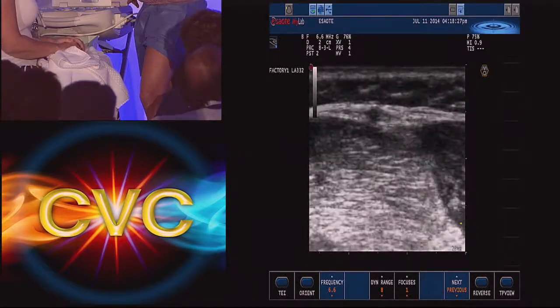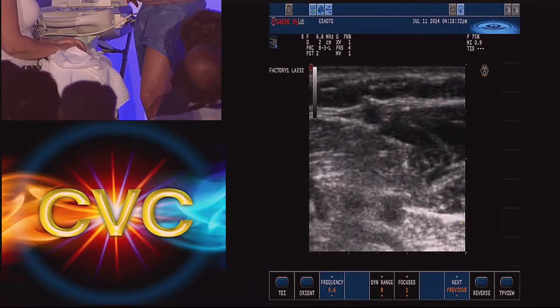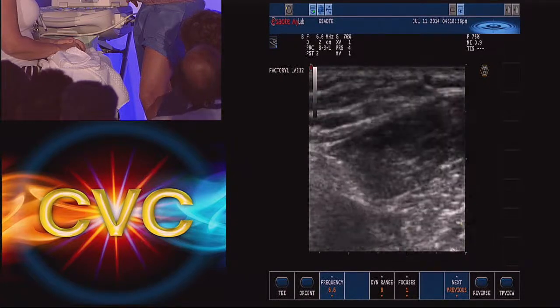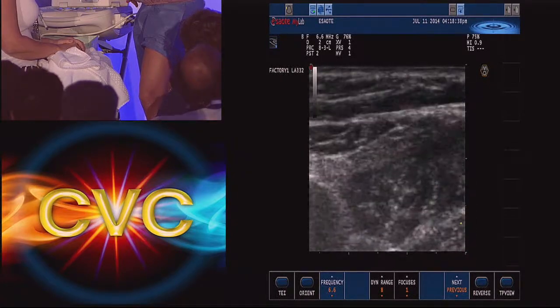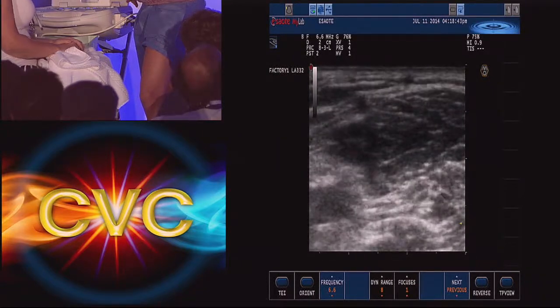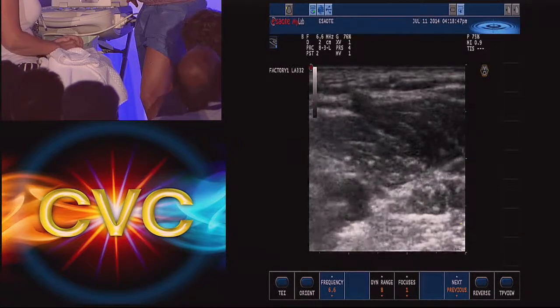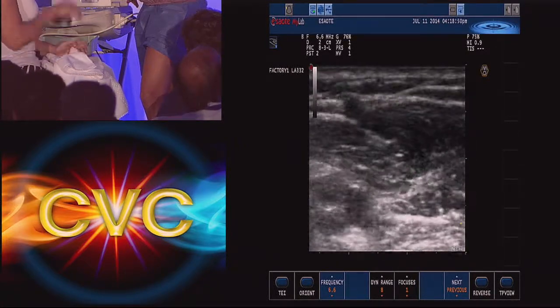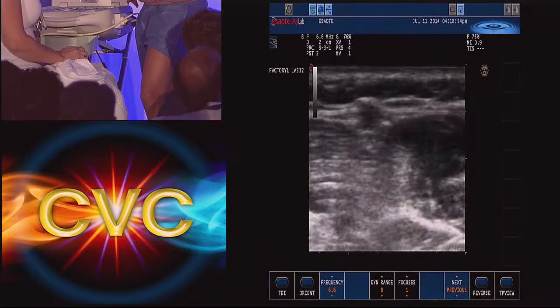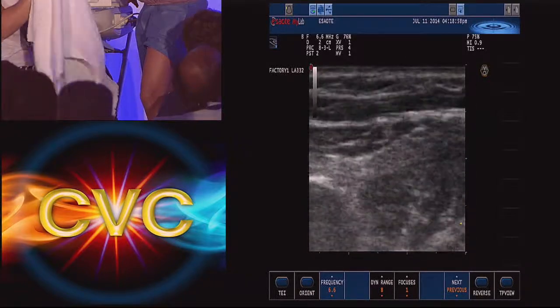Yes. And if you saw those presentations where the nerves go right by, you have the posterior tibial and the saphenous nerve, those are the areas where the nerves are very close by. Can you slow down just a touch and see if you see any nerve in that sheath as well? Sometimes you'll see the nerve right next to it. It's hard to pick up, but sometimes you'll see it. All right, no worries. Let's get somebody who has some reflux and go.